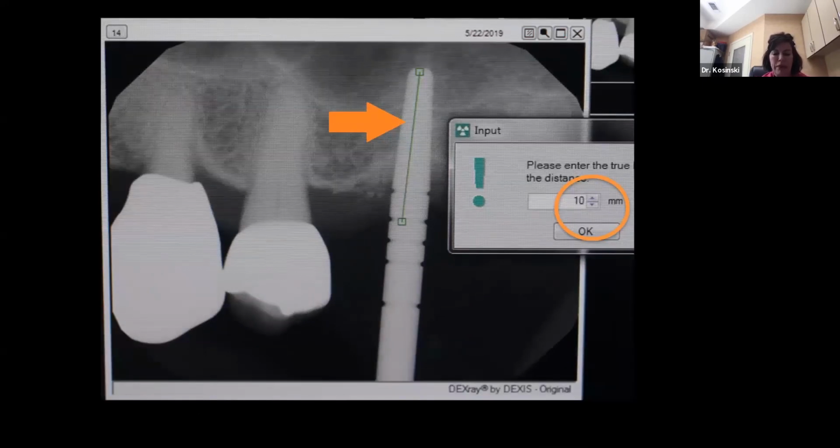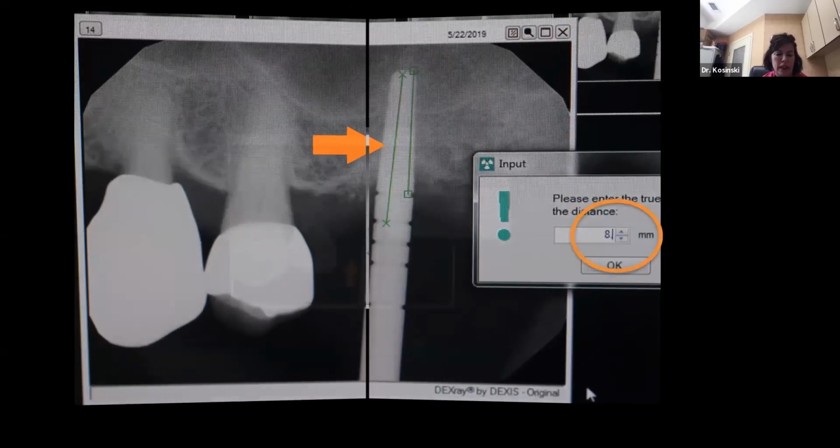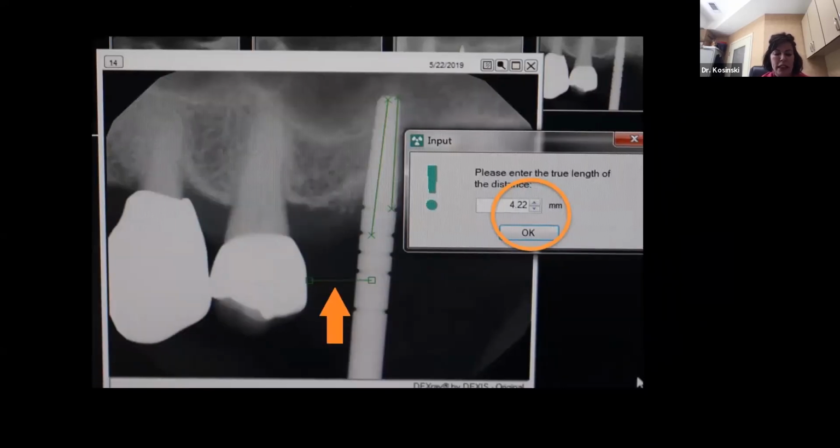I measured 10 mm from the soft tissue height. This means that I am now 8 mm into available bone, lifting the sinus floor about 3 mm without perforation. I can confirm my distance from the tooth to the center of my preparation. I'm always checking my position radiographically to ensure that I'm going to be able to create a nice implant retained crown.